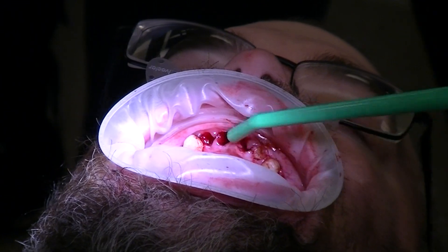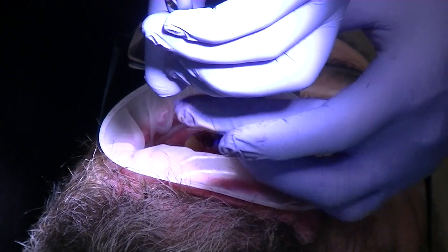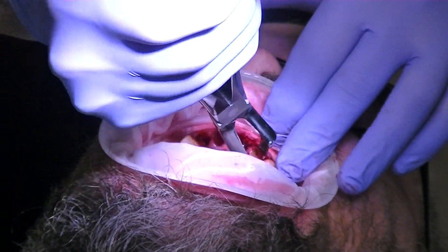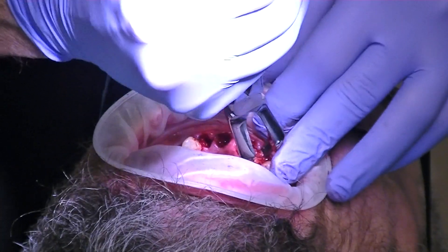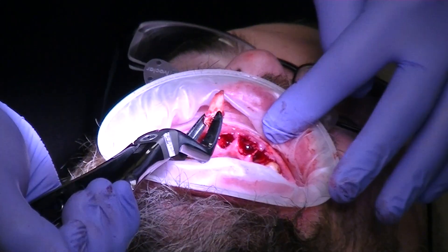We're going to go ahead and grab that and rotate, then just do the twist. Grab on the solid tooth structure — and we got it out.